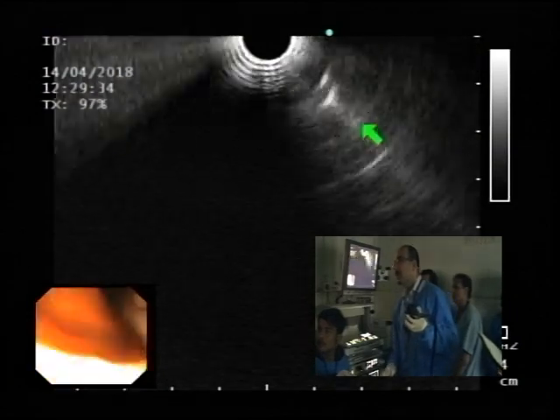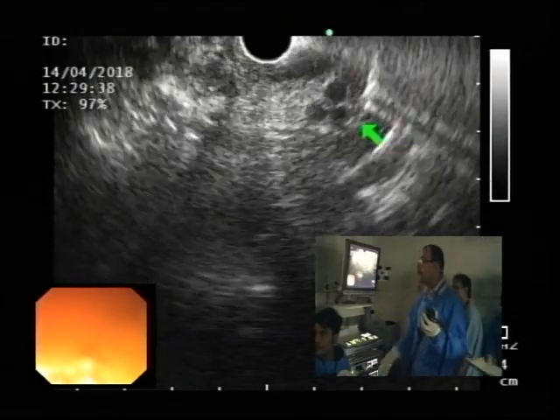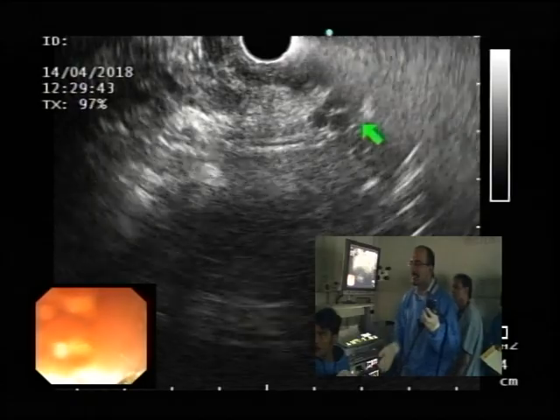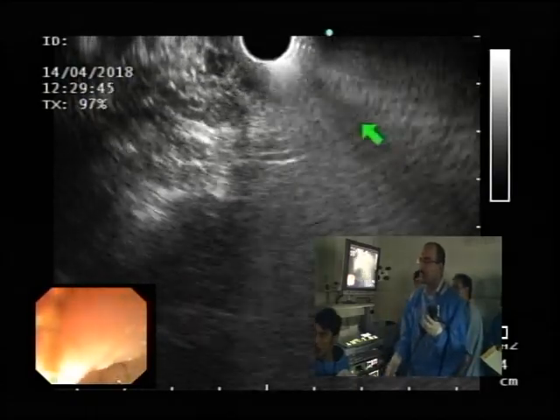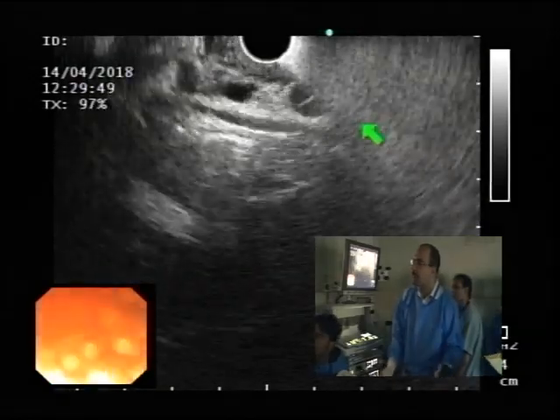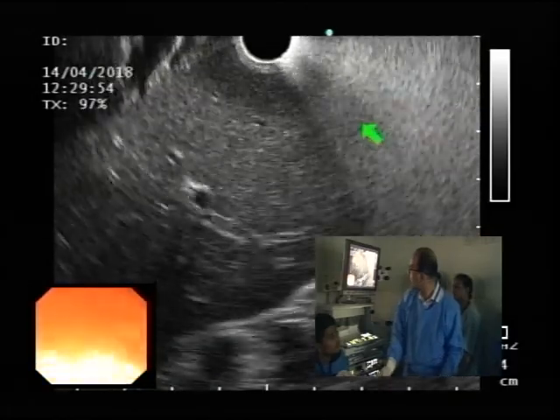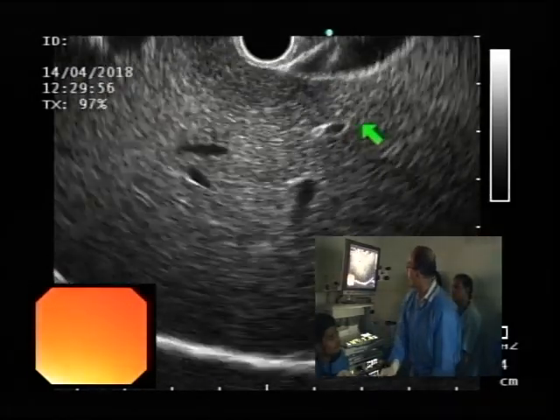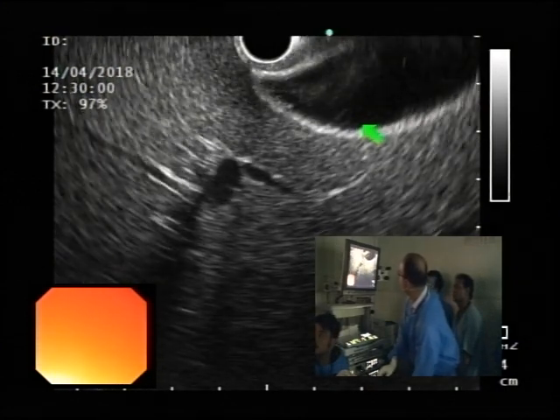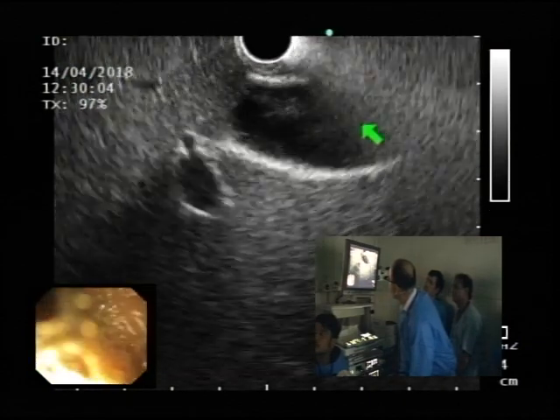So this is again that long position, and the minute you enter the bulb, I will typically look for the duodenal bulb views of the bile duct, portal vein. There are maneuvers, subtle movements, but as soon as you're through, you have to relax, you drop your hand, so you're looking into the liver, and as you push in and go counter, once you have the liver in view, the gallbladder has come up. I'm stuck on the gallbladder, and I'm just going to change my small wheel left and right.